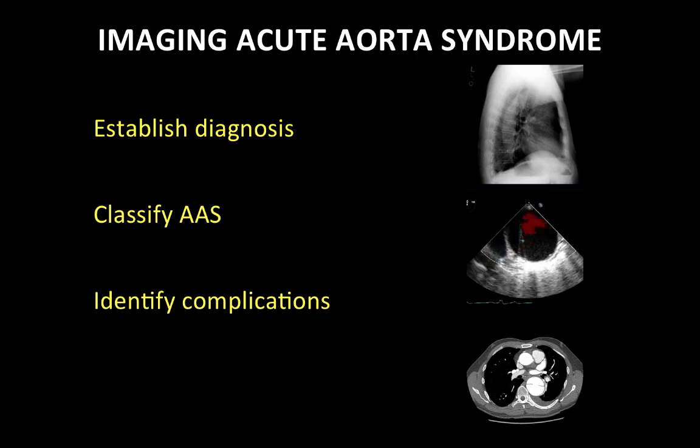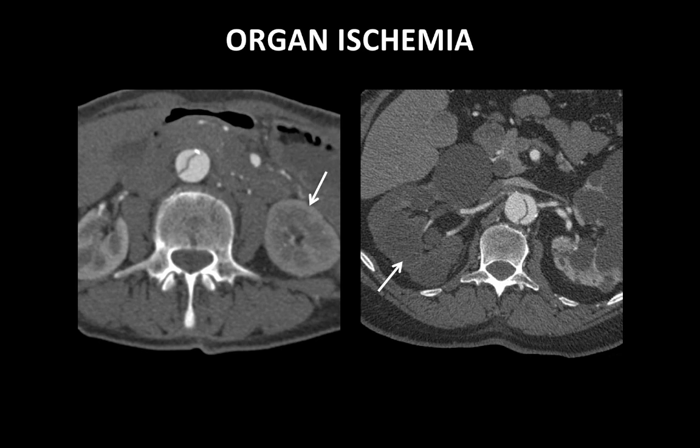The final topic that I want to cover is the identification of specific complications that will help sway management from either medical to surgical or vice versa. And probably the most important of these is whether or not there are any signs of end organ ischemia.